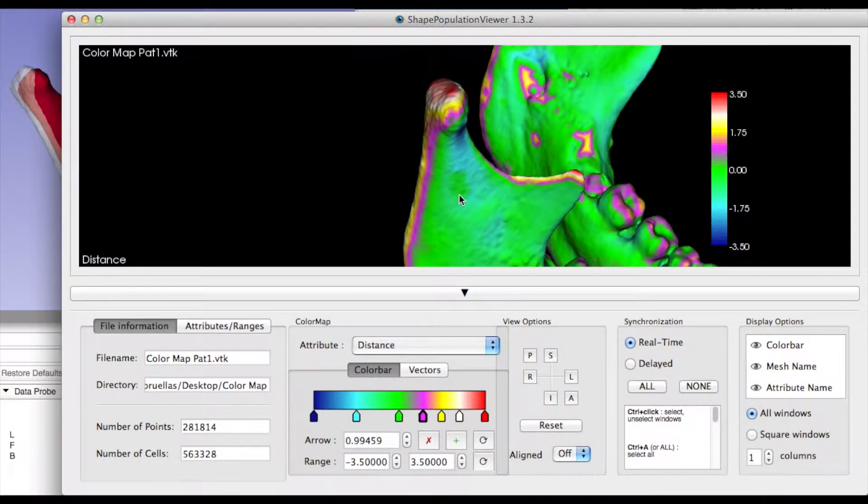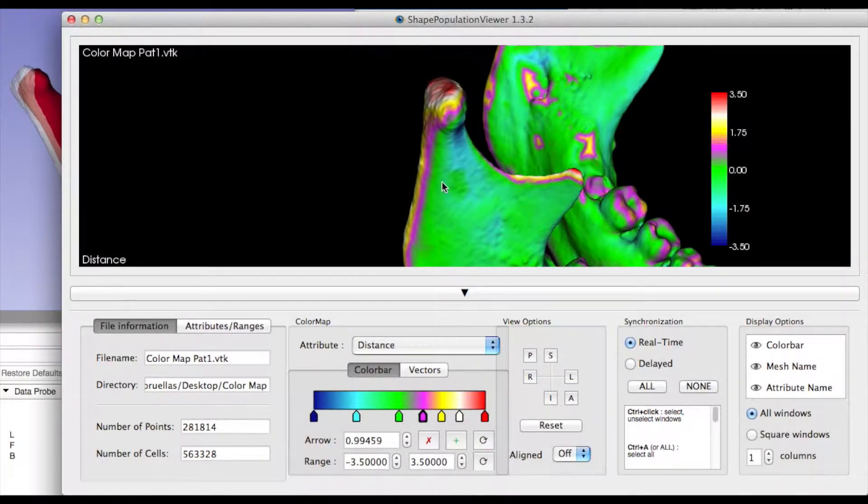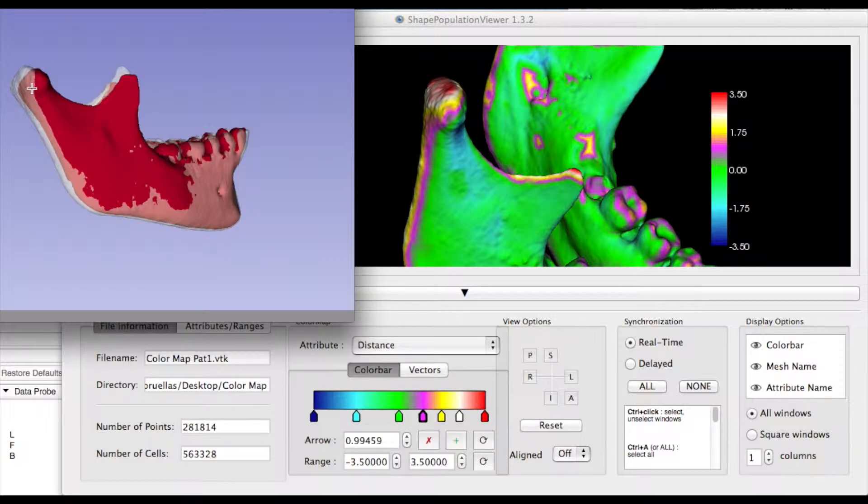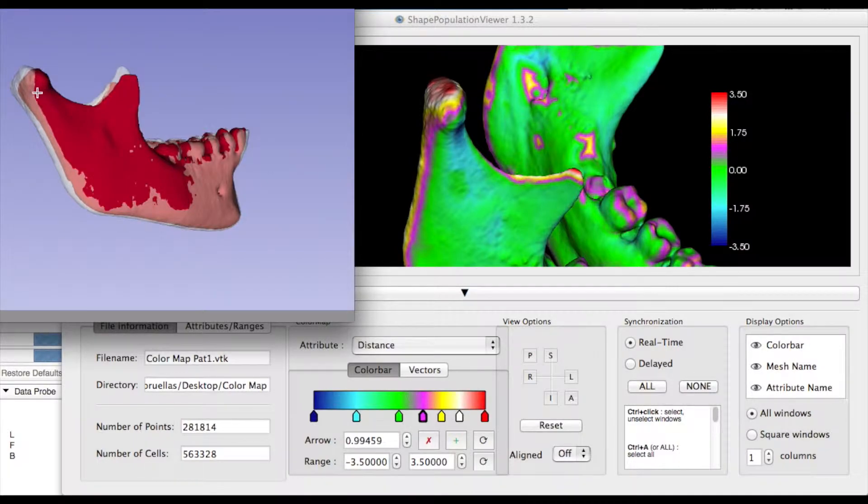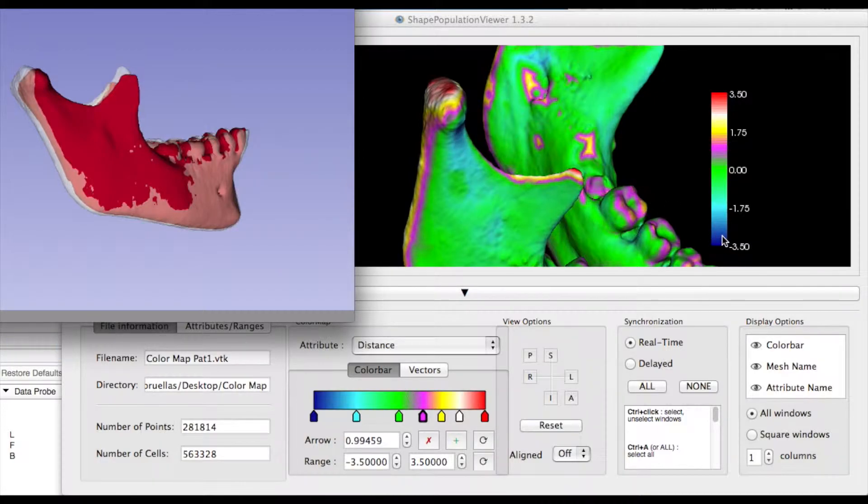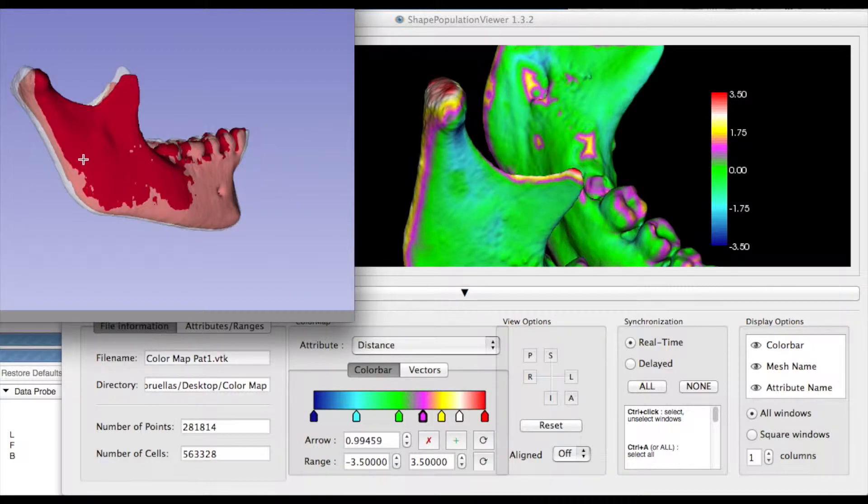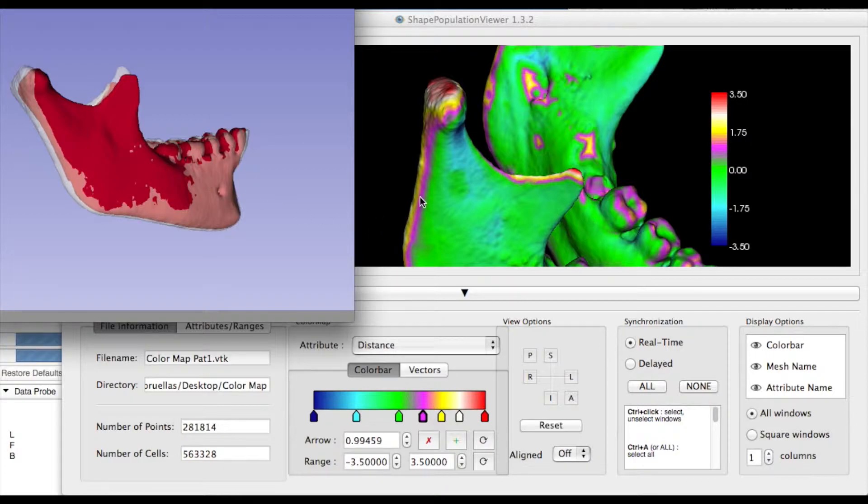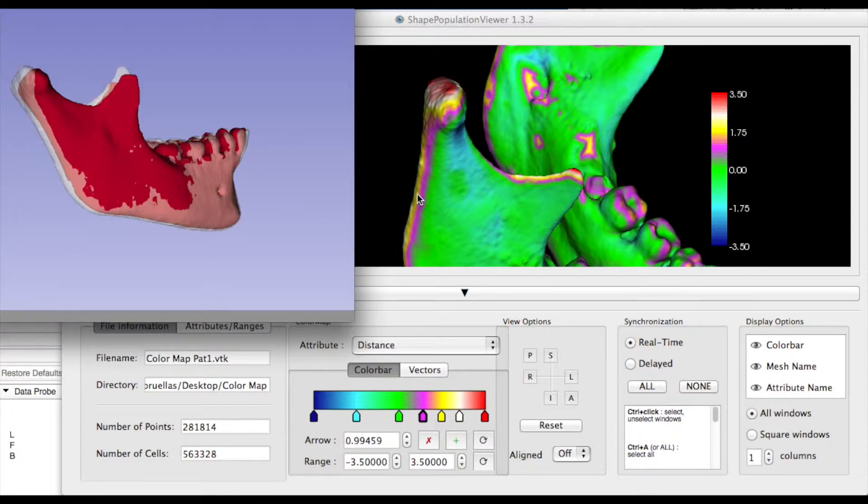When the color map is zoomed in and compared to the overlay, we observe that the condyle had a posterior displacement due to resorption in its anterior area marked as dark blue and corresponds to negative 3.5 millimeters. The posterior part of the ramus showed bone growth and is displayed as yellow that corresponds to 1.75 millimeters.